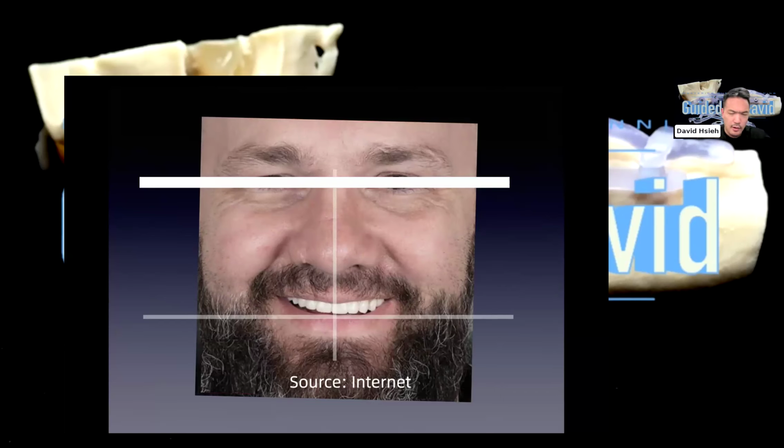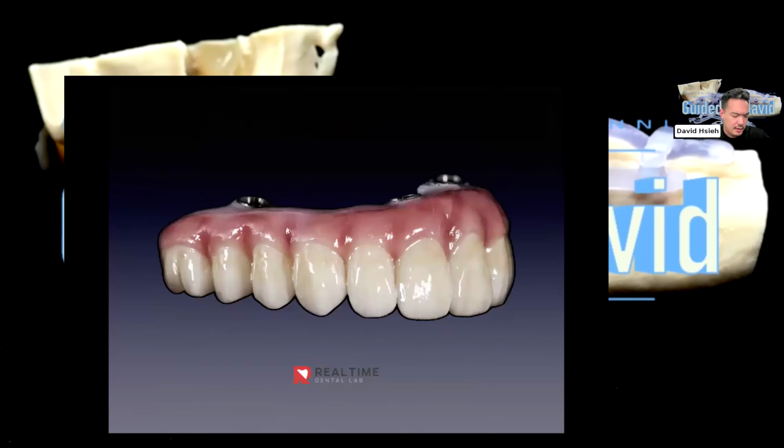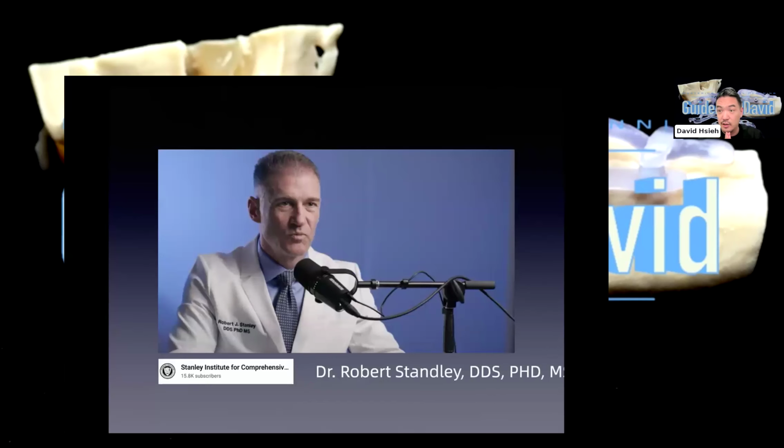So it all comes down to the prosthesis, right? What is a good prosthesis? Does it look very vivid, with so many characteristics within? Is that a good prosthesis? If we know what a good prosthesis should be, then we know how to make the treatment planning correctly.